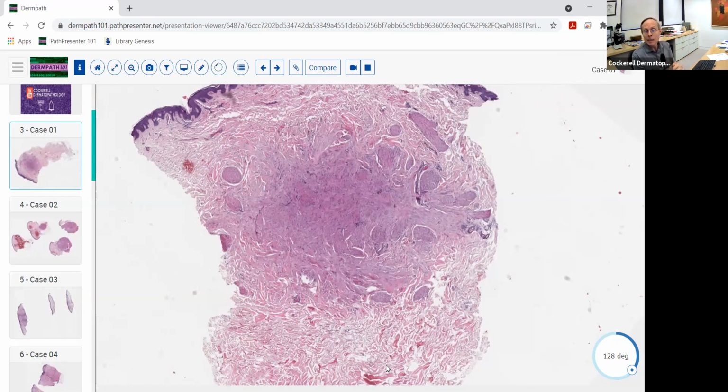If you start seeing a lot of mitoses, maybe 5, 6, 7 or 8 in the lesion, or maybe there's 3 or 4 per high power field, even though the lesion looks relatively small and symmetrical, you need to be sure that it's not evolving into a leiomyosarcoma in that situation. And we'll talk about that in a minute when we talk about an atypical leiomyoma.